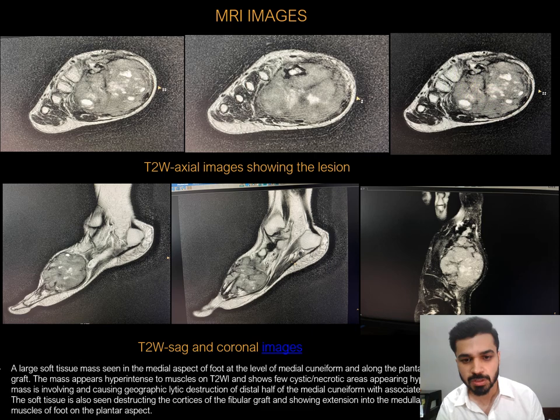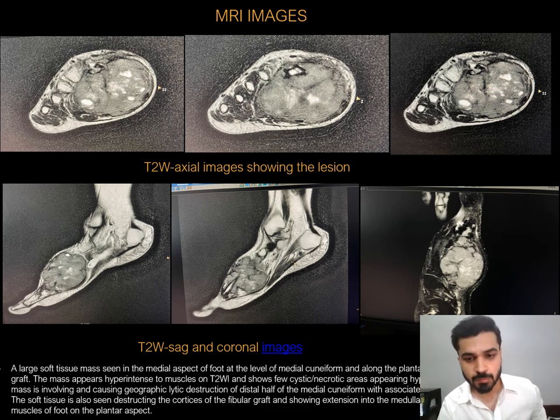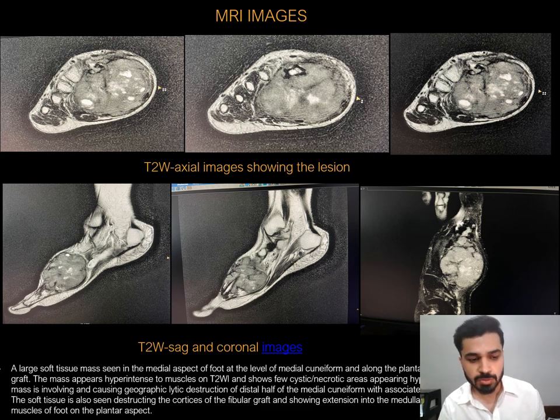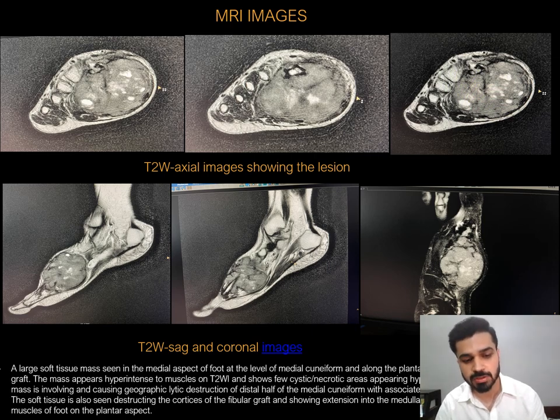On axial, sagittal, and coronal MRI images of the right foot, a large soft tissue mass is seen in the medial aspect of the foot at the level of the medial cuneiform, along the plantar, medial, and lateral aspect of the fibular graft. The mass appears hyperintense to muscles on T2-weighted images and shows few cystic and necrotic areas appearing hyperintense on T2. The soft tissue is causing geographic lytic destruction of the distal half of the medial cuneiform with associated expansion and cortical destruction, and is also seen destructing the cortices of the fibular graft with extension into the medullary cavity. There is marked splaying of the muscles of the foot on the plantar aspect.